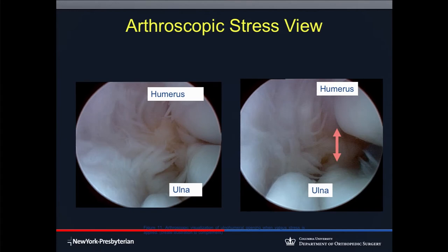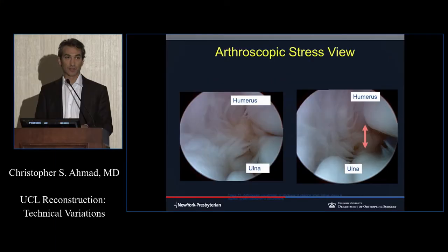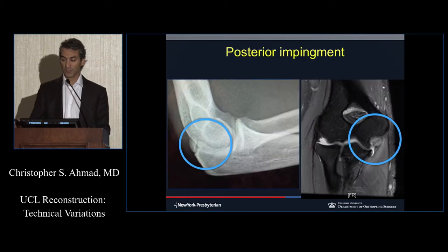Stress view, like if you were going to take an x-ray, or now more commonly an ultrasound, you can see it open up. And there was a time when people would do arthroscopy and decide, based on this, if they were going to continue and go forward with the reconstruction. I think at this point in time, most people are committed to the reconstruction ahead of time. Now it's sometimes a question at the time of surgery, is it going to be a reconstruction or a repair? This is what it's really good for.